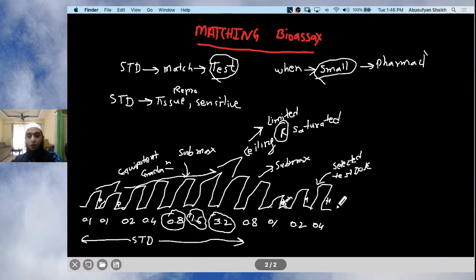Now again, if you want to confirm that the response of 0.4 ml is exactly 14 mm, then you can give one more dose of 0.4 ml of the test. You observe that when you measure the height, it is exactly the same as the earlier response of 0.4 ml. You got a height of 14 mm. So it indicates that the test dose you have selected is the right one. There is no mistake or error. Till this point, you have given the test dose.